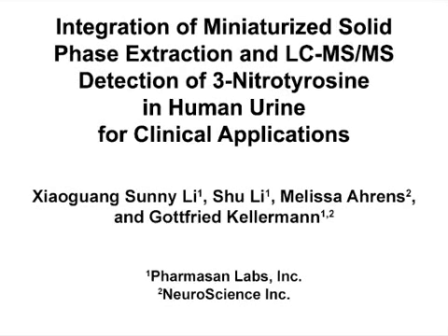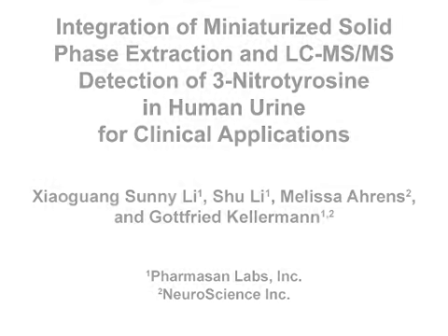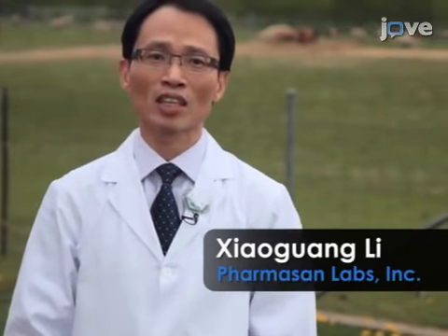The overall goal of this miniaturized solid phase extraction combined with LC-MS/MS assay is to accurately quantify free 3-nitrotyrosine in human urine for clinical applications. Free 3-nitrotyrosine has been used as a biomarker for oxidative stress.